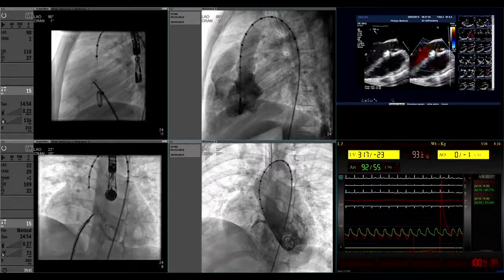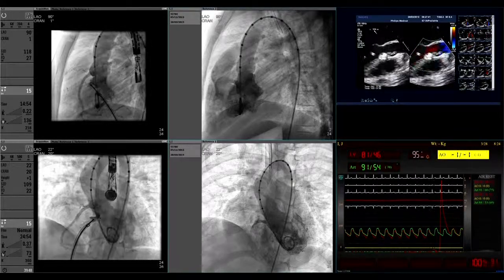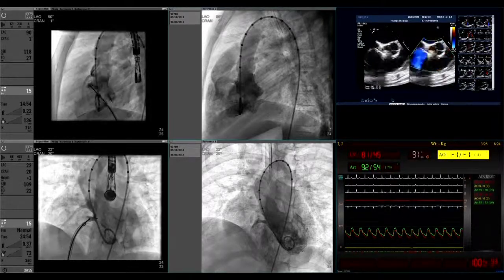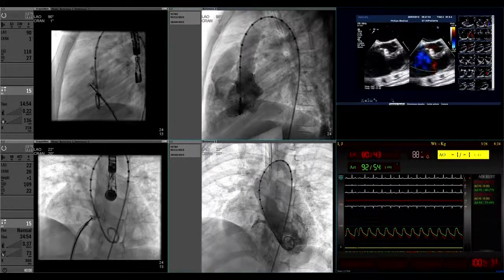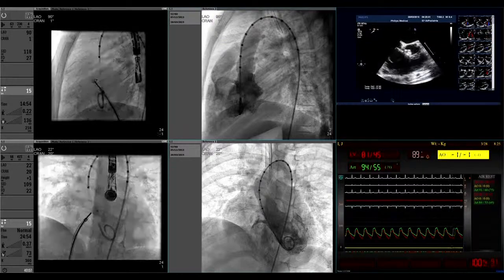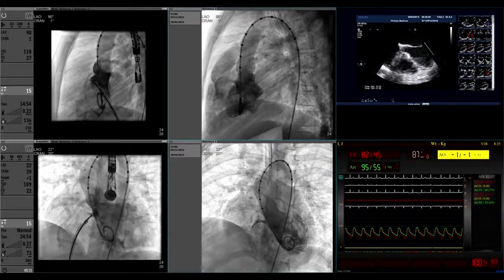What do you think? Looks good. Beautiful. You think the device is still in the left side a lot? In the left side, you want to bring back to the right side a little bit more, or is it okay? Yeah, the right ventricular disc is showing a little bulge, and there is a waist formation. So I think your device is quite stable. Nicely done. Yeah. Can I ask you guys to measure the waist of the device? It means we don't want to oversize a lot.